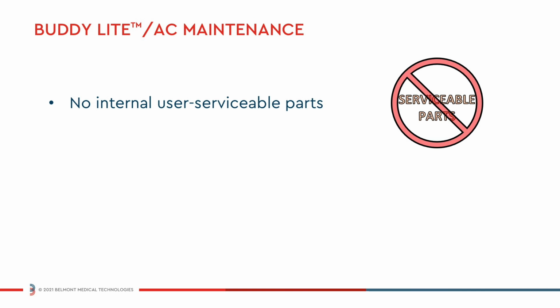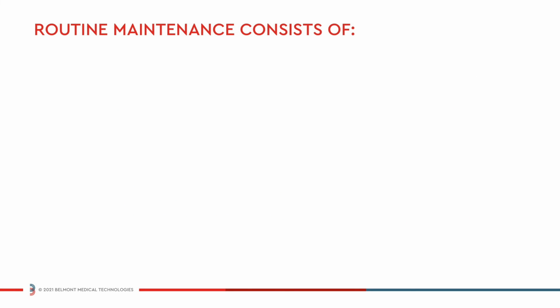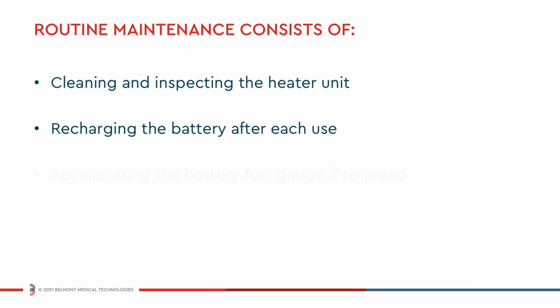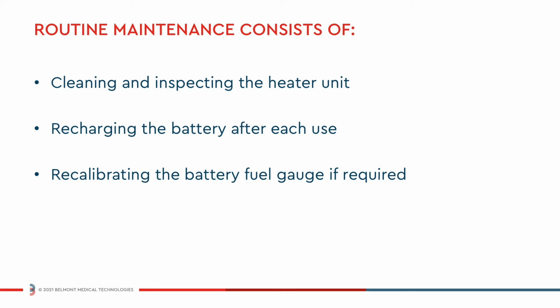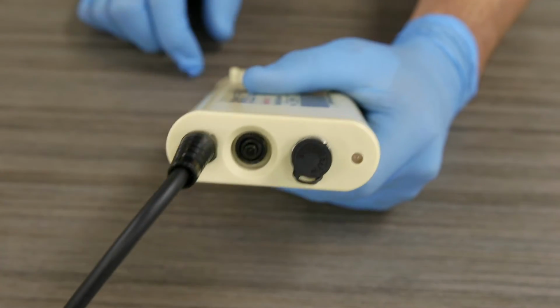The system has no internal, user-serviceable parts and does not require calibration except to recalibrate the battery fuel gauge. Routine maintenance consists of cleaning and inspecting the heater unit, recharging the battery after each use, and recalibrating the battery fuel gauge if required. To clean or disinfect the system, first, power off the device.